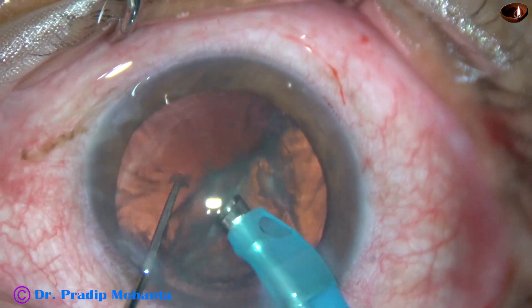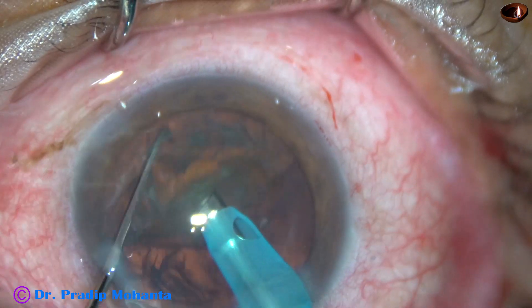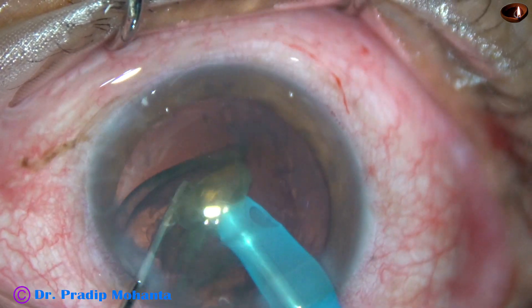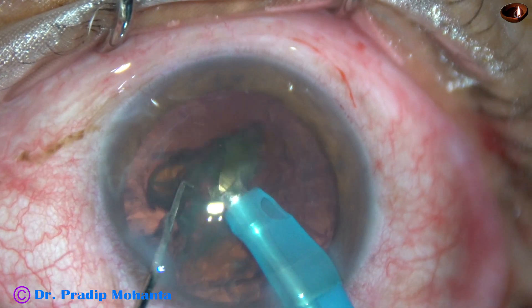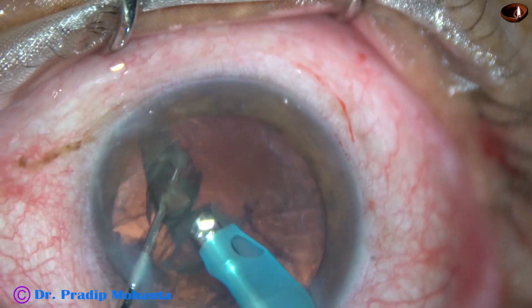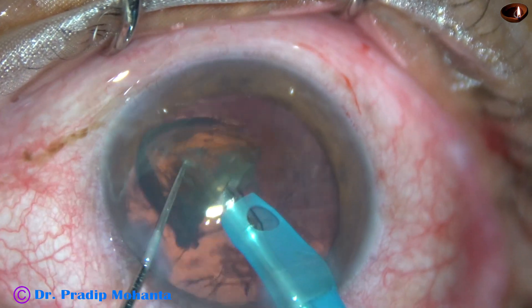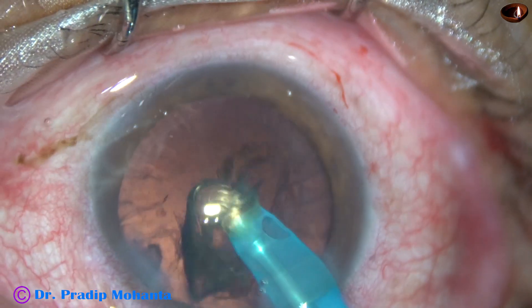Now I turn the other hemi-nucleus and engage it here and chop it. Mechanical chop could have been done in this case if I had planned it that way, but it didn't happen. Anyway, we have managed this case beautifully by stop-and-chop technique.